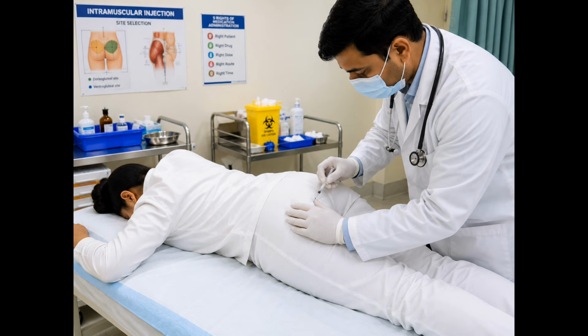Hand hygiene is performed before preparing the medication. The healthcare professional gathers sterile equipment, including the prescribed medication, syringe, needle, alcohol swabs, gloves, gauze, and an approved sharps container. Maintaining a clean workspace and using aseptic technique are essential for reducing the risk of infection.